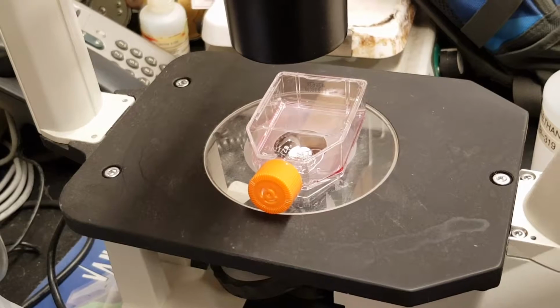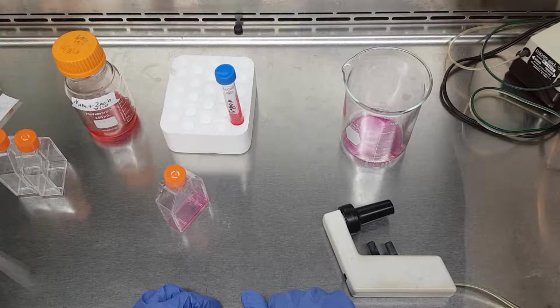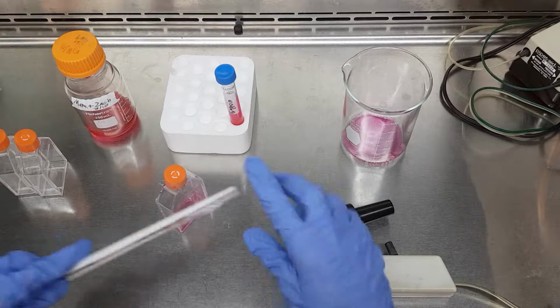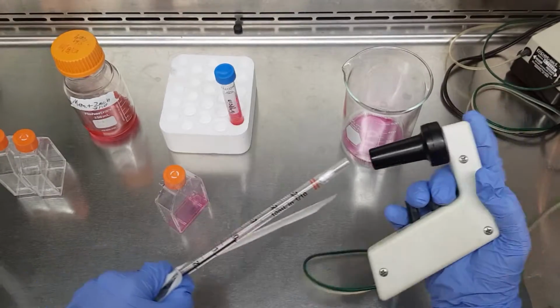If it's over 80%, the cells will need to be split. Remove the media from the 25 cm squared flask containing the cells using a pipette, being careful not to disturb the cell layer.